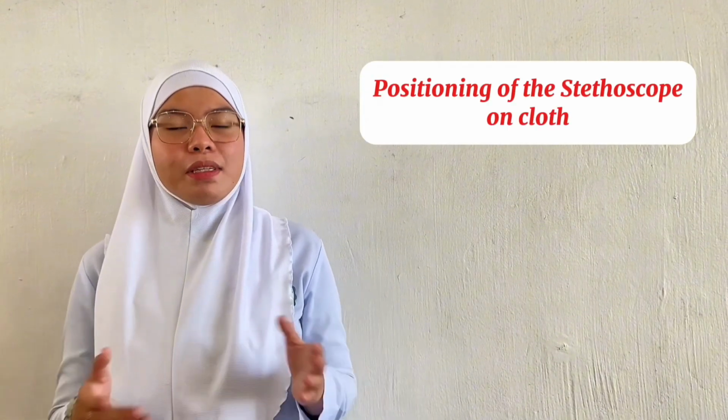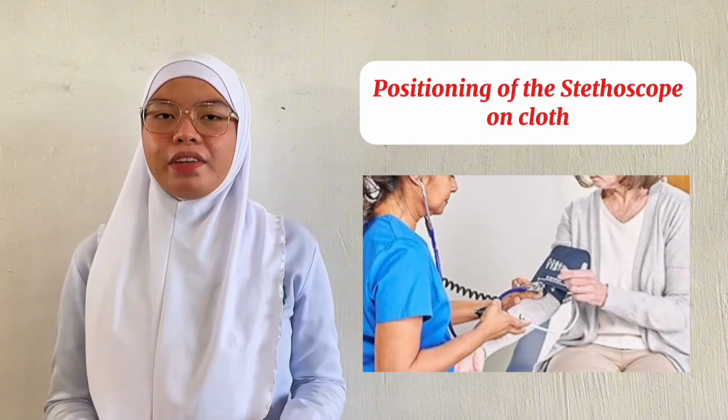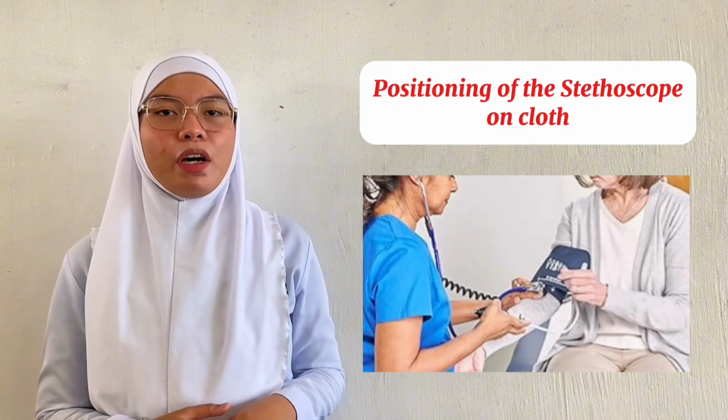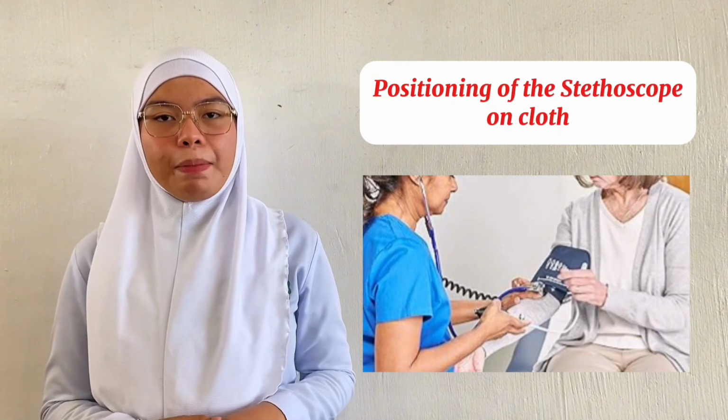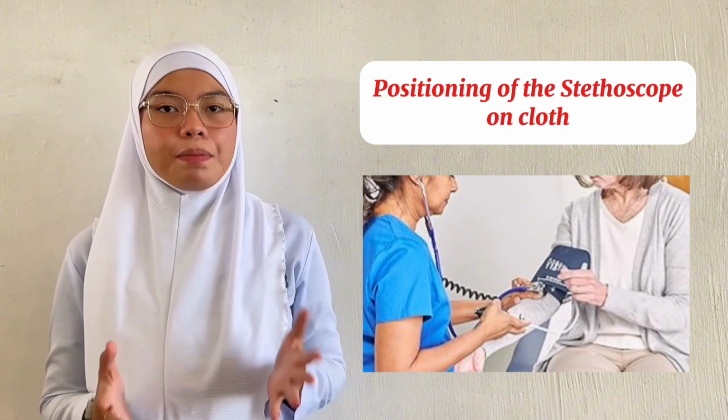Fifth, positioning the stethoscope. There is a misconception that a thin fabric doesn't affect the sounds. But in reality, the stethoscope must be on bare skin. Clothing dampens the sound or creates friction noise that mimics the Korotkoff sounds, leading to inaccurate readings.